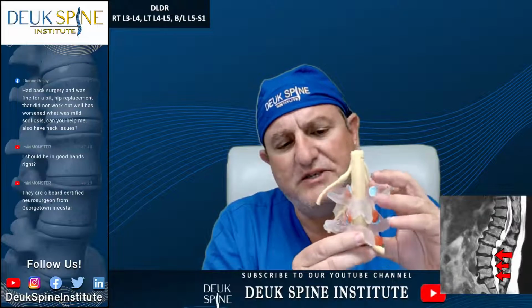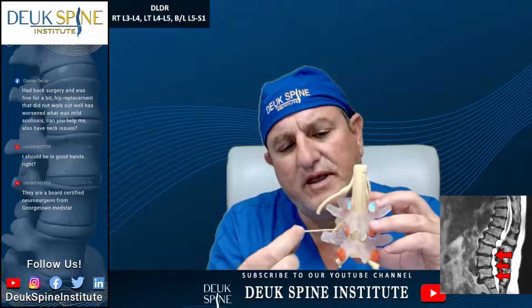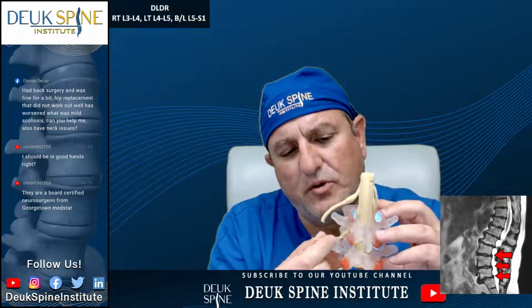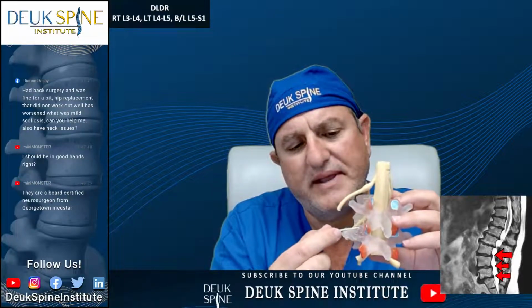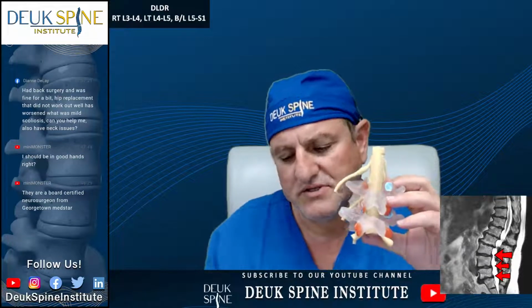So to fix this patient's back, I came in from the side and went through a hole that's already there called transforaminal. So I kind of had my needle bump against the facet, and then I brought the needle down into the disc right where the tear was.